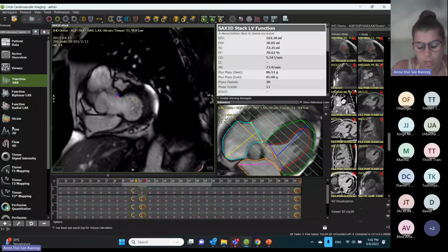And then, when the hospital or doctor is deciding to purchase something, he can decide whatever he wants to. But for the trial period, yes, we will include everything, and you will have the possibility to try and test everything you want. Right.